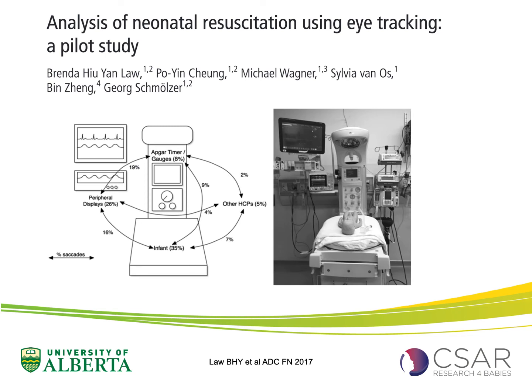Now, what is the problem from a human factors perspective to integrate a respiratory function monitor in the delivery room? There are a couple of studies out so far to assess what it means to have all this equipment, including a respiratory function monitor, which you can see here right in the middle, to the left of your resuscitation table. The problem is that a lot of the time, when people stand at the head and use all these technologies, they look away from the baby.